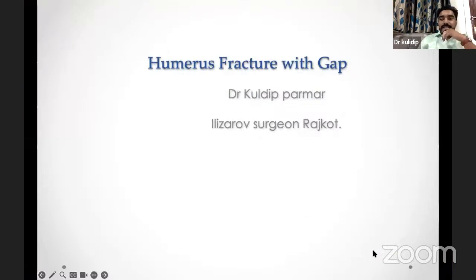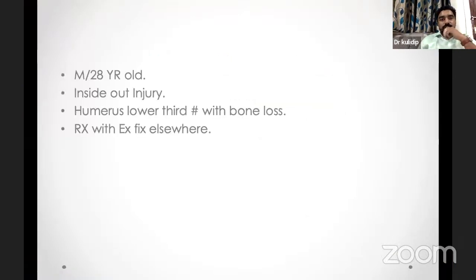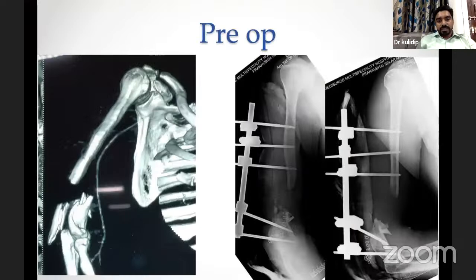So I practice in Rajkot, Saurashtra region of Gujarat. This was a 28-year-old male. He had an open inside-out injury, had a lower third humerus fracture with bone loss, and was treated with X-fix elsewhere. Here is the CT scan.